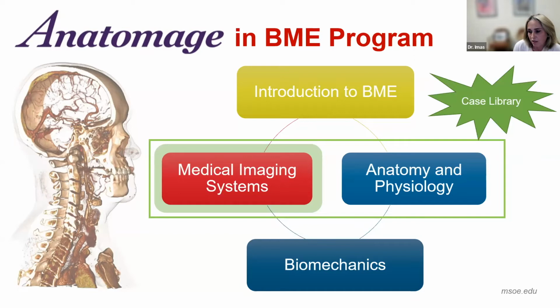And the reason this was challenging to do in the past, or it is challenging still, I would say, is because it is challenging to get access to a sufficiently large number of clinical DICOM imaging data sets, those that come with medical histories annotated by radiologists that have some ground truth defined in those images, that have artifacts and pathologies and just interesting findings overall and variability from one image set to the next and so on. So that's one reason.